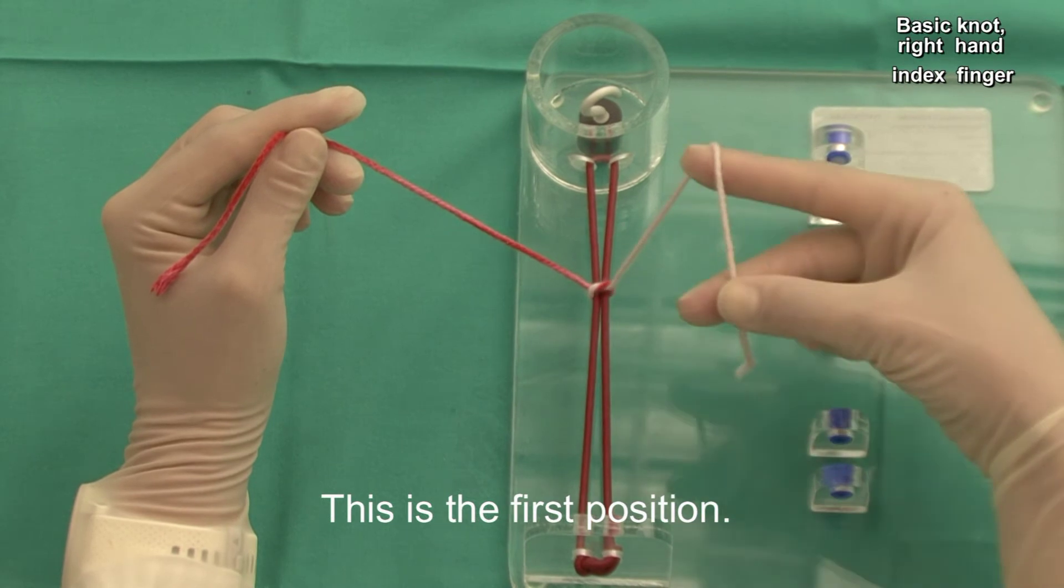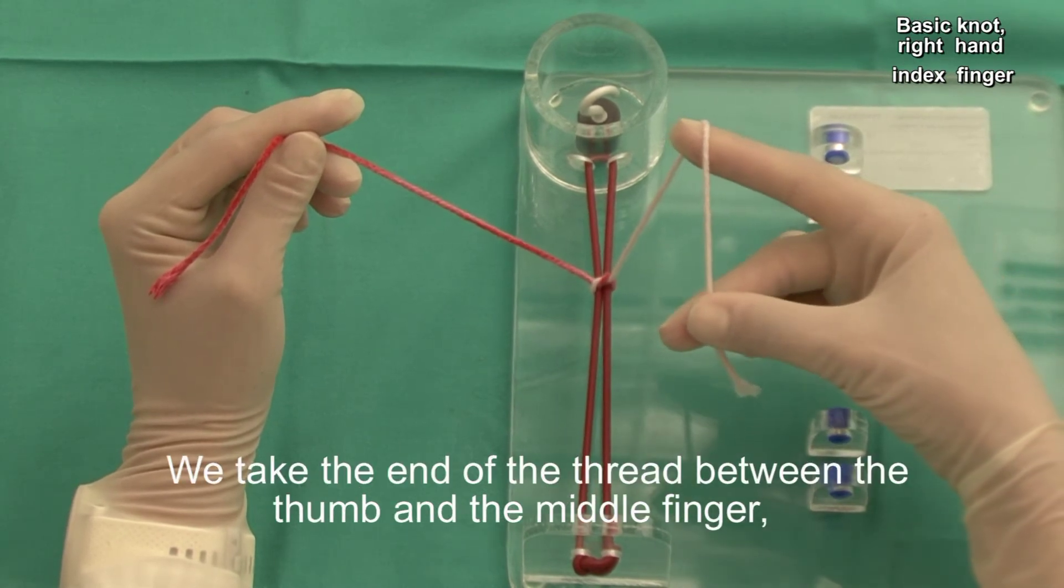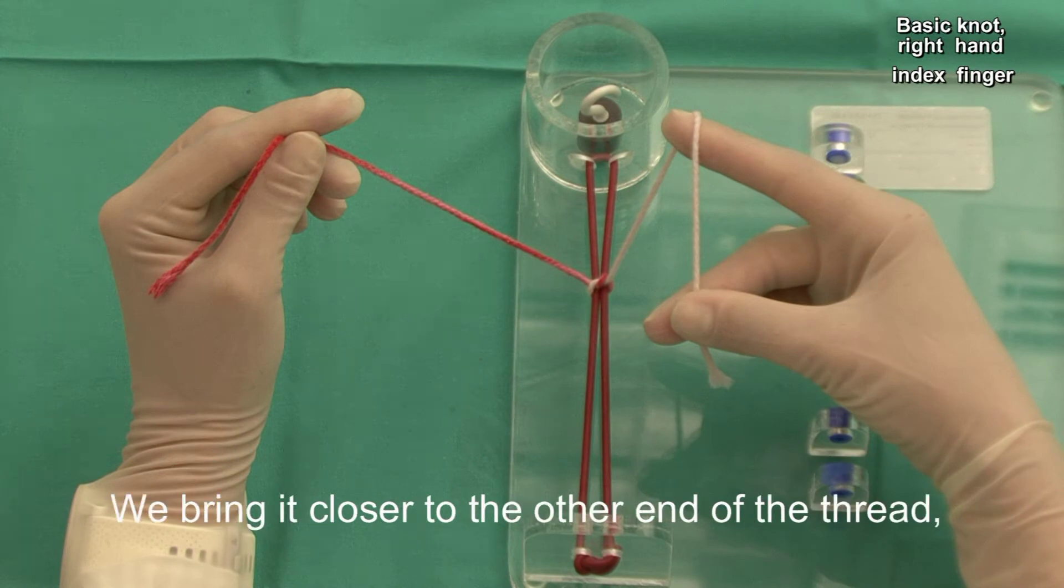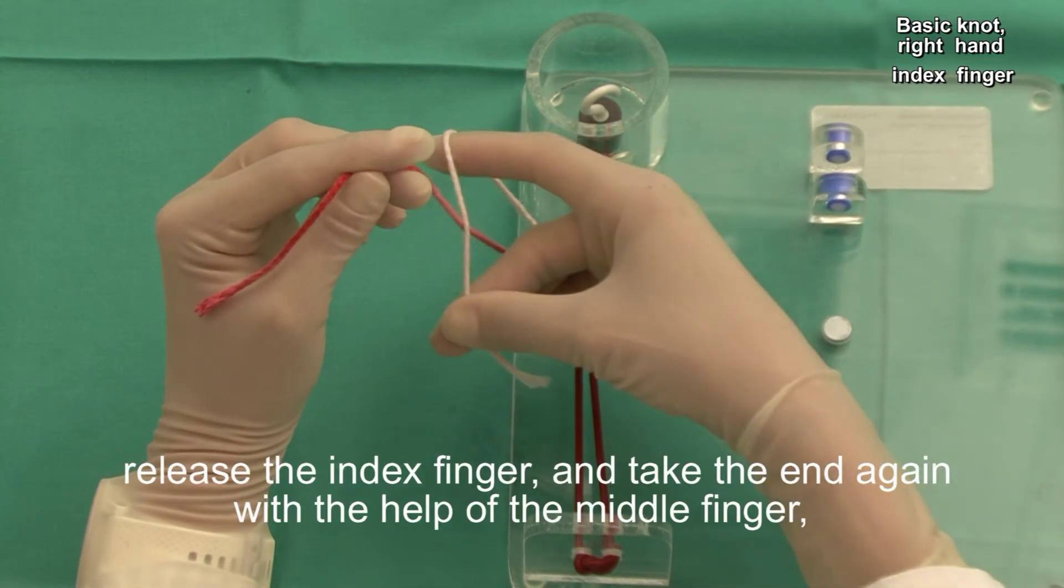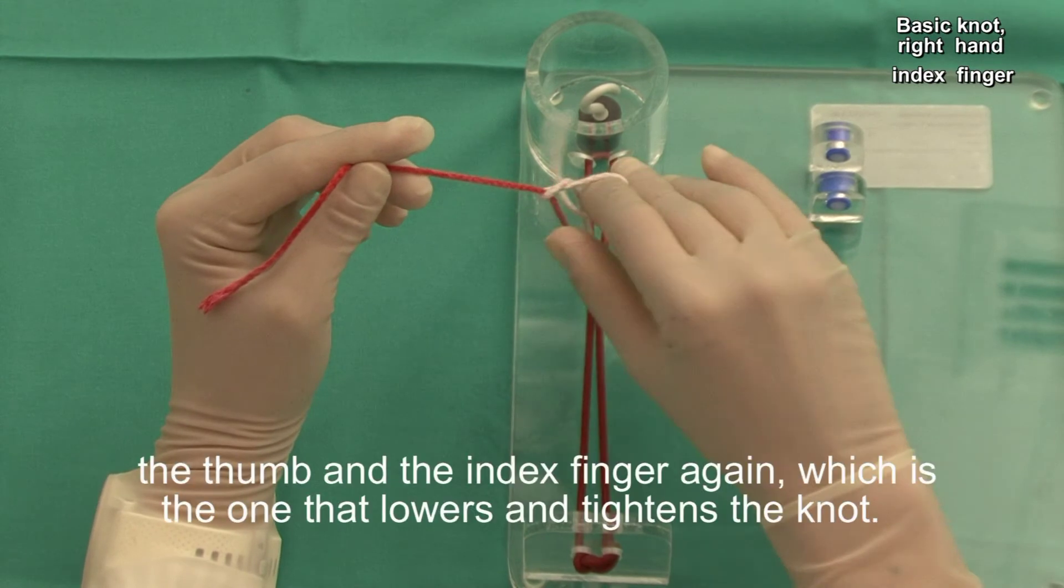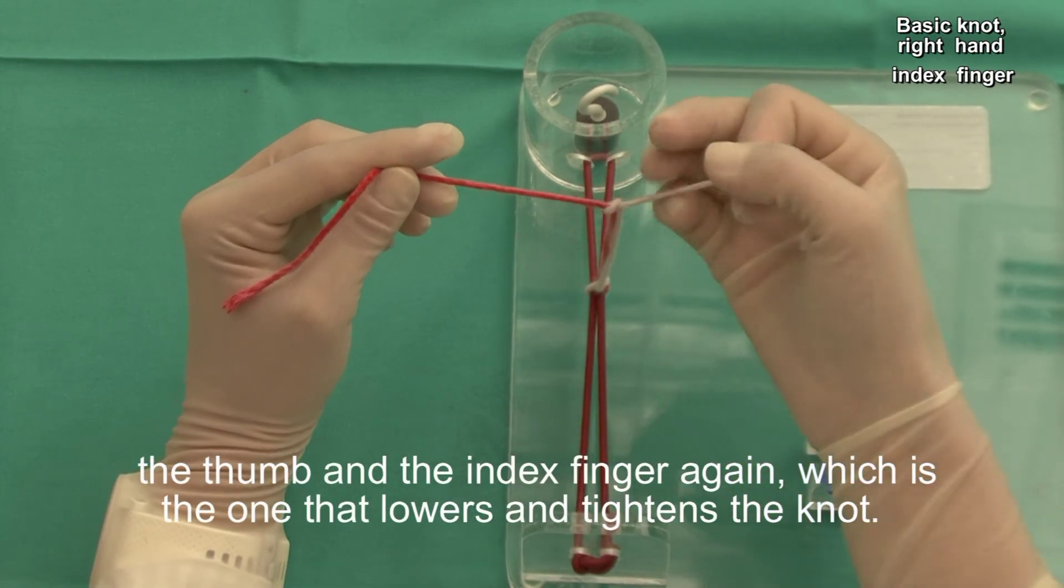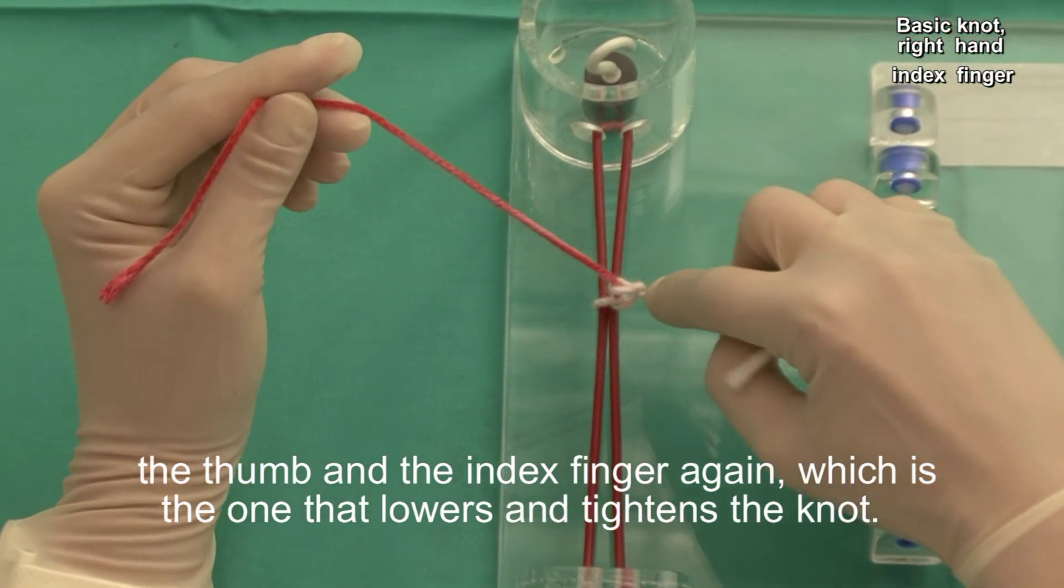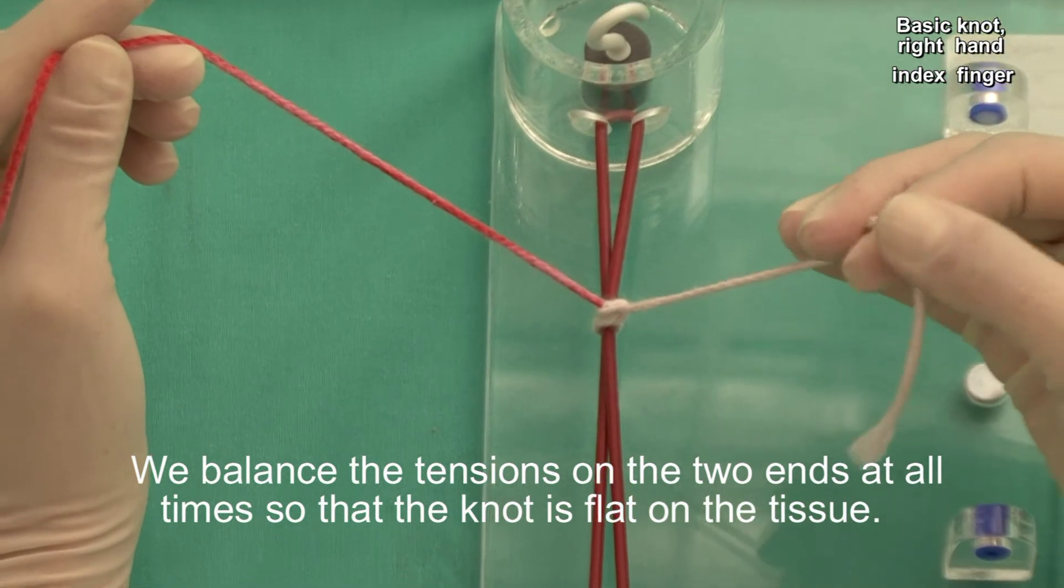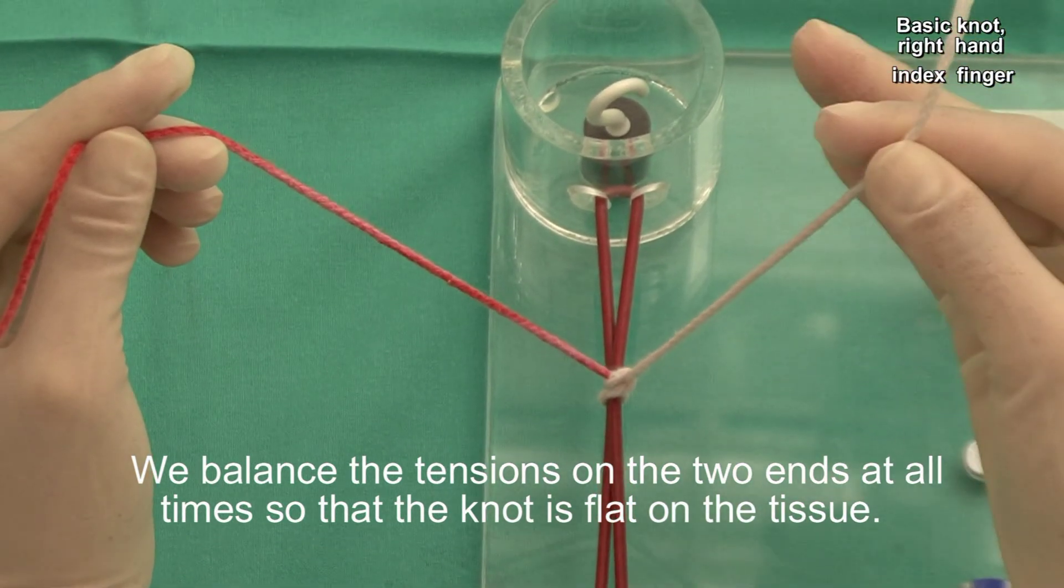This is the first position. We take the end of the thread between the thumb and the middle finger and we tighten with the index finger. We bring it closer to the other end of the thread. Release the index finger and take the end again with the help of the middle finger. The thumb and the index finger again. We lower and tighten the knot. We balance the tension on the two ends at all times so that the knot is flat on the tissue.